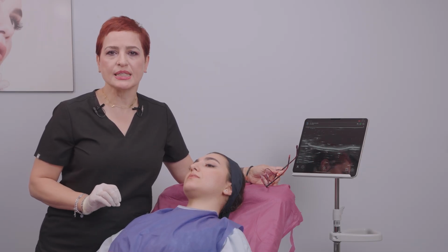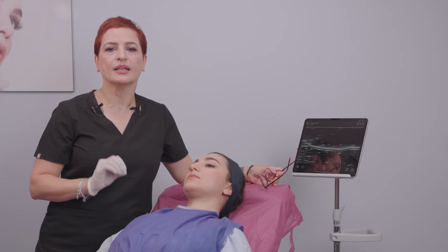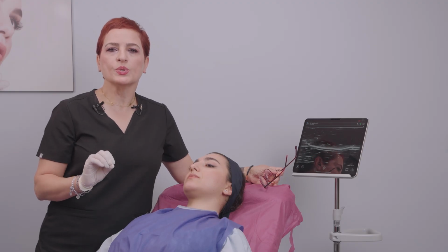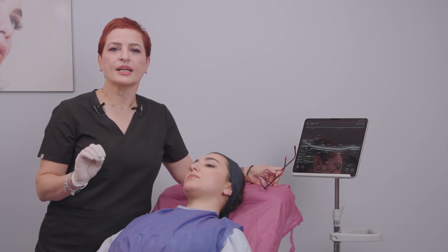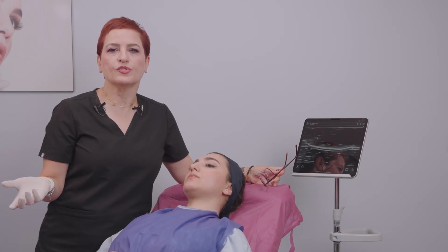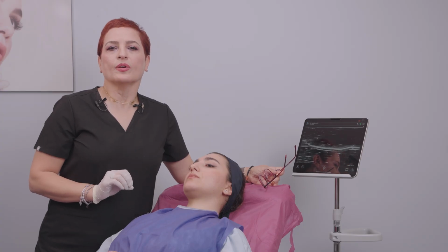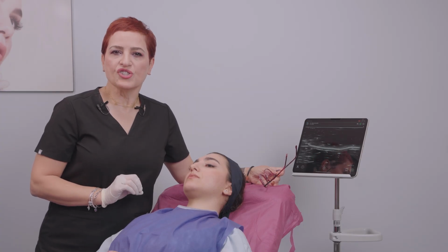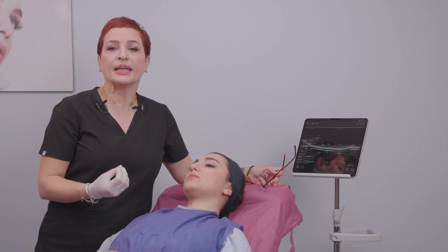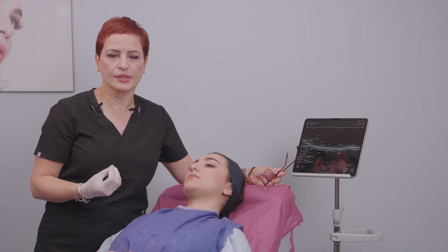The echogenicity and the thickness of different layers of the skin as well as superficial fat are very important to choose the precise and better treatment for the skin. If we see signs of aging, we can decide how to pick the best treatment for unique patients.